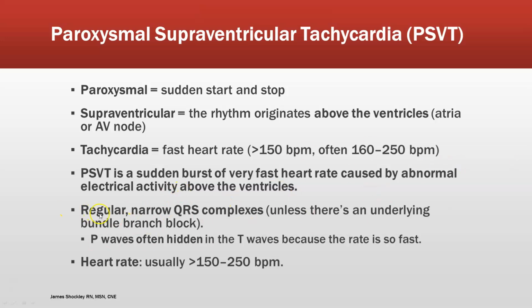Again, we should be looking for regular, narrow QRS complexes. Sometimes those P waves can be hidden, and that's why I said we're just going to look at that QRS if we can't figure out, okay, is this really an atrial tachycardia or SVT, or is it something else?